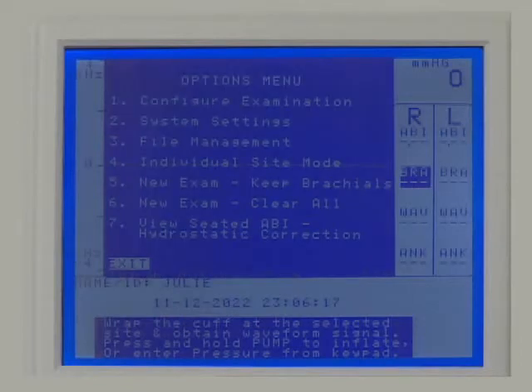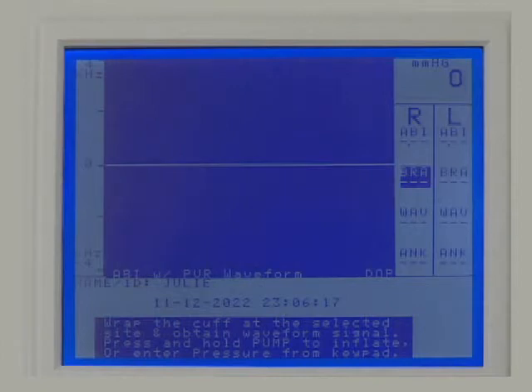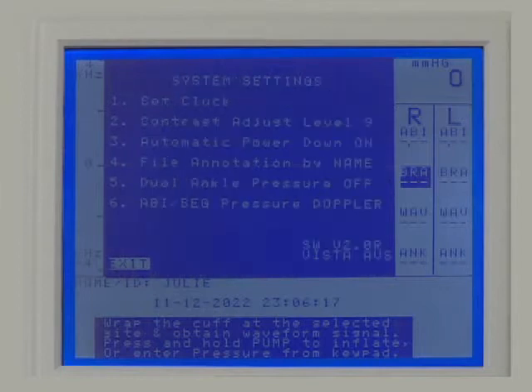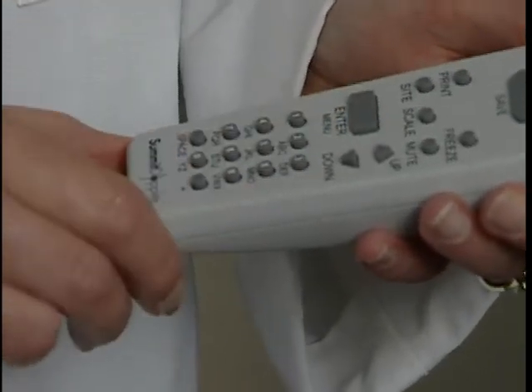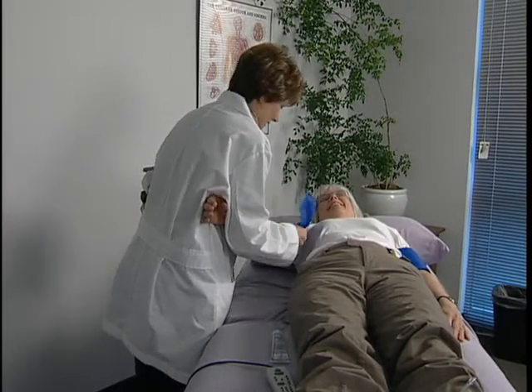Press Enter/Menu to open the options menu again and press 1 to configure the examination. Press 1 again to select ABI with PVR waveform. Press Enter/Menu again to open the options menu and press 2 for system settings. Press 6 to select Doppler for obtaining pressures, then press Enter/Menu to exit.